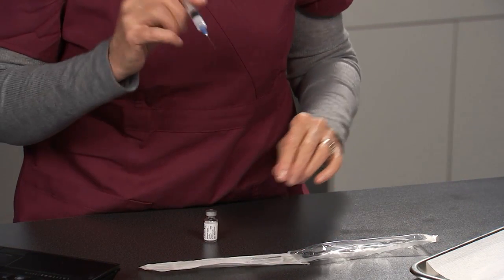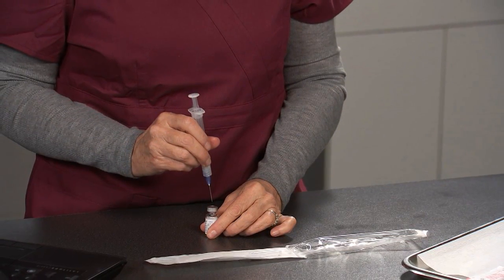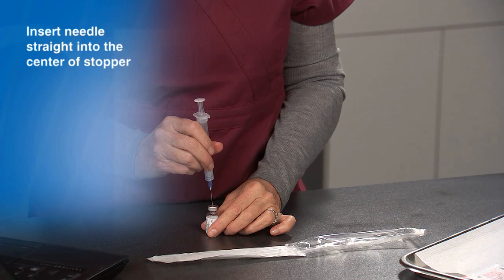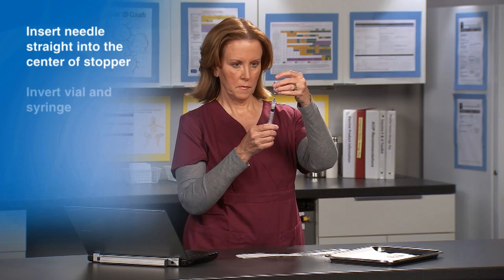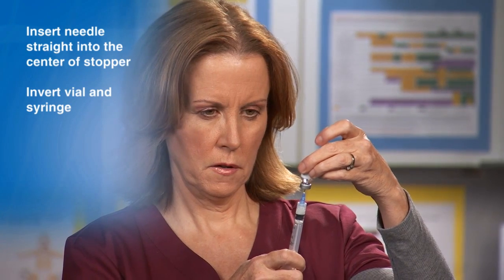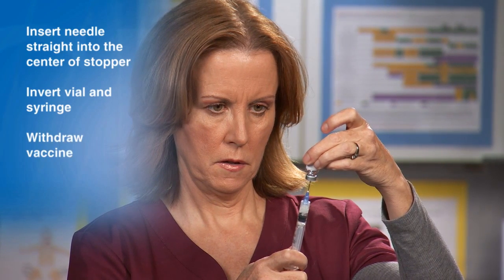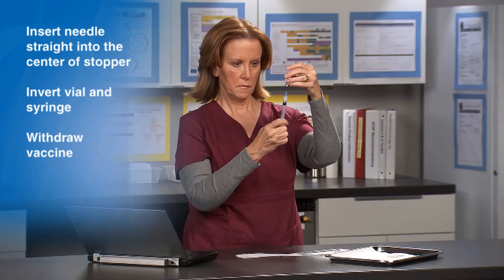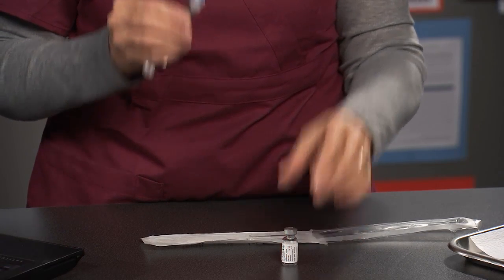Hold the vaccine vial on the counter with your non-dominant hand. Holding the syringe with your dominant hand, insert the needle straight into the center of the stopper. Pick up the vial and syringe together, then invert them. Hold the vial and syringe at eye level and carefully pull the needle back so the tip is in the liquid. Withdraw the vaccine by pulling on the plunger of the syringe. Fill to the dosage mark on the barrel of the syringe. Now, remove the vial from the needle and return the vial to the counter.